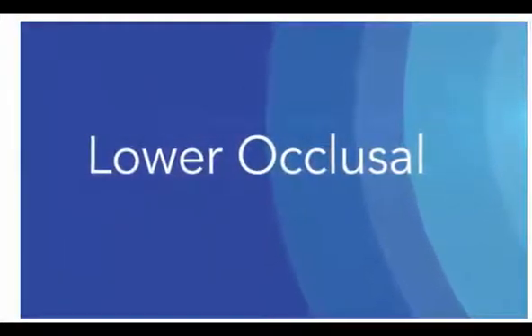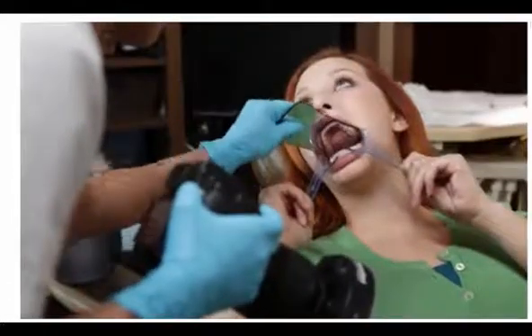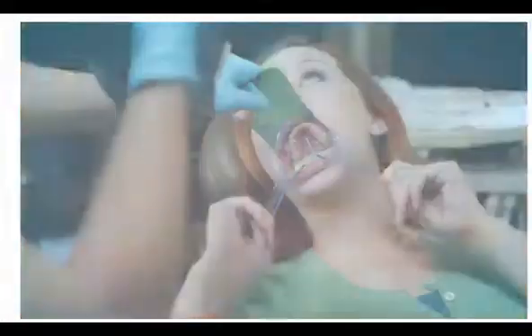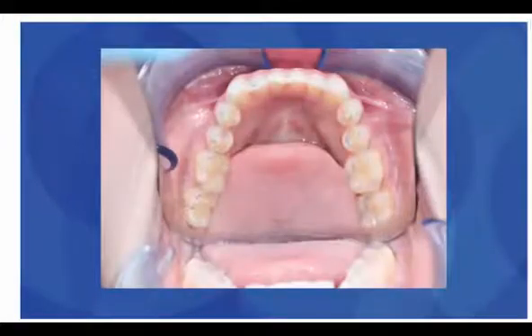Repeat the same process on the lower arch. Insert the lower retractors and position the occlusal mirror at the rear of the lower terminal molar, while resting the front of the mirror on the upper incisors. Again, have the patient hold the retractors as shown. Position the camera at a 60-degree angle from the mirror's surface, compose the photo, and take the shot.